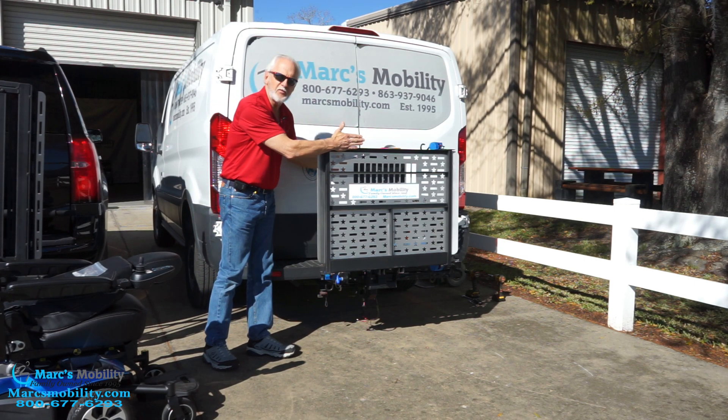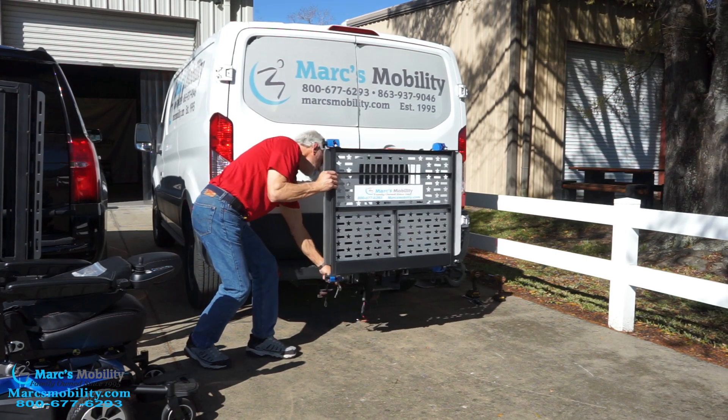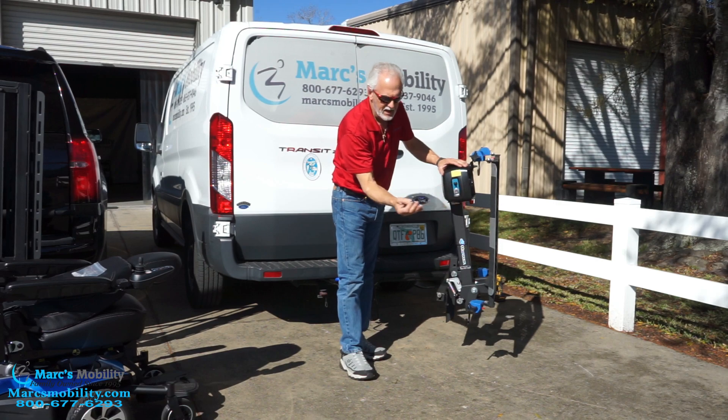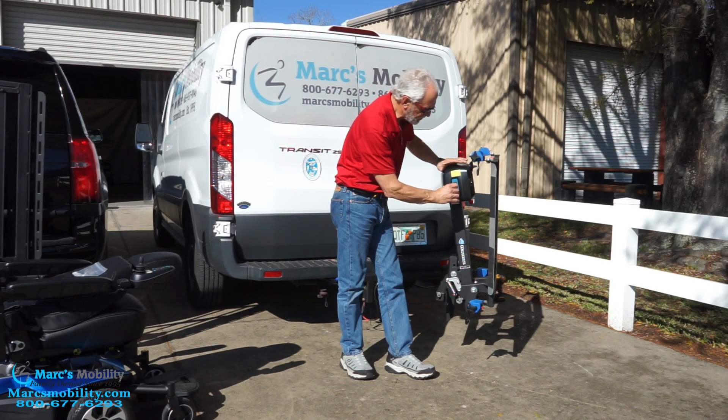You're about 18 inches from your vehicle when it's flipped like this — 18 inches. Also, you can see you have two keys. Once the chair is up, nobody can take your lift or your chair.